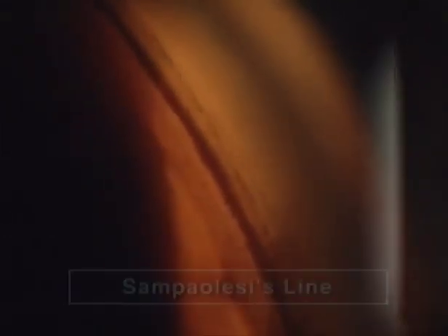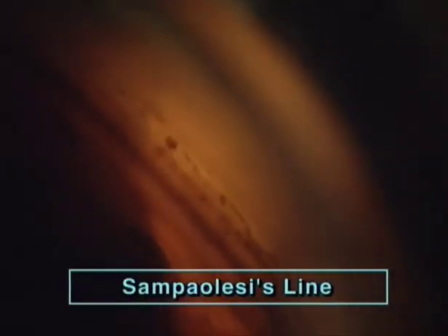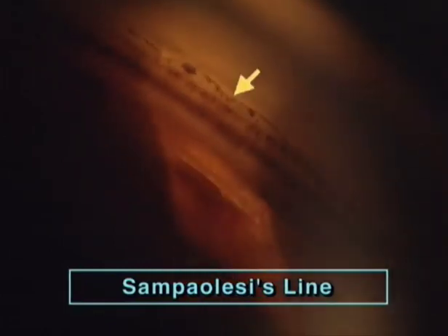Here we see the endopigmentation in more detail, with its typical unsaturated brown colour and with hazy contours, which, when found in the upper angle, is a good indication of pseudo-exfoliation syndrome. When moving laterally, Schwalbe's line becomes more and more pigmented and we can recognise single granules. And when approaching the bottom, we observe the third pigmented zone in front of Schwalbe's line, the so-called Sampaolesi's line, which is diagnostic of pseudo-exfoliation syndrome.